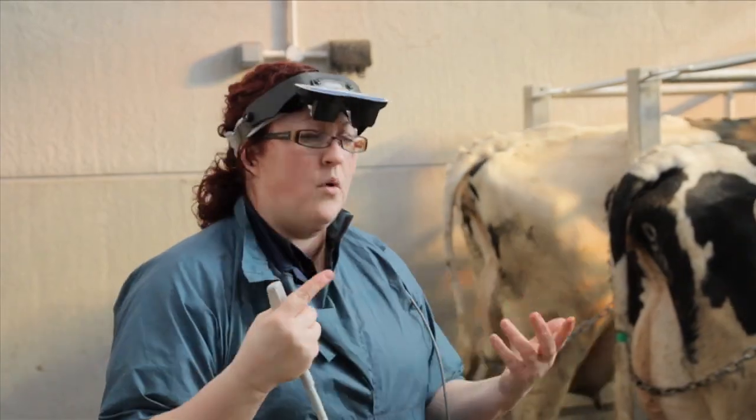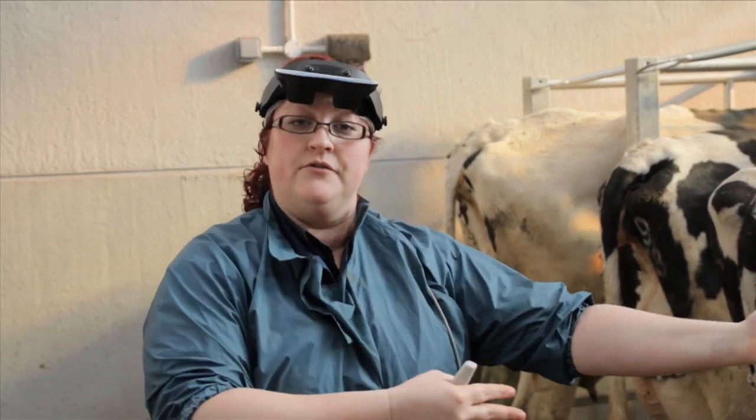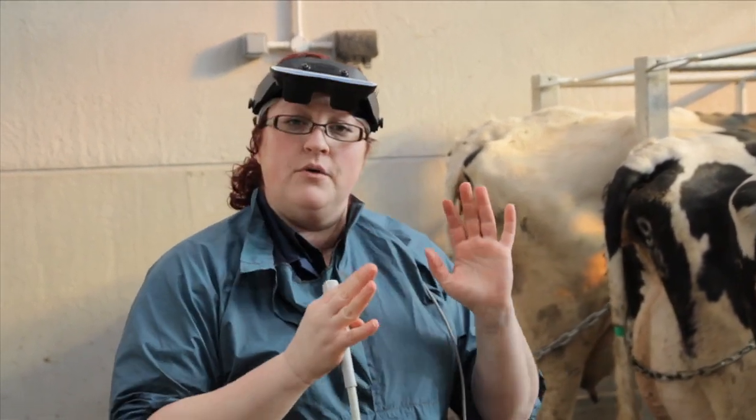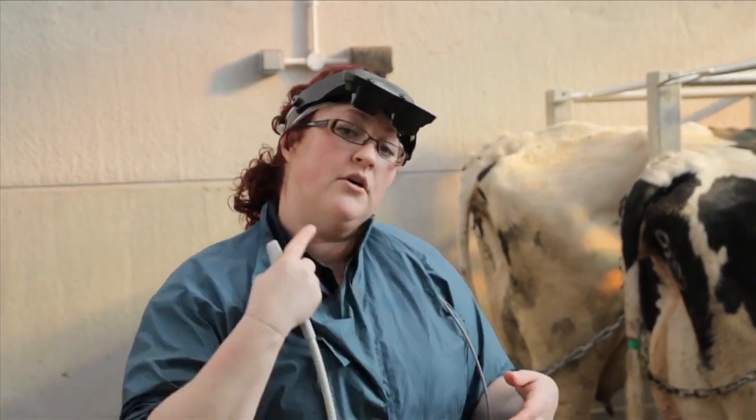What these goggles will allow us to do is actually view the ultrasound image while retaining our peripheral vision. This is important in a farm environment to ensure, again, safety. If you're using a stationary machine with a monitor, just make sure, again, that it's out of the primary footfall of people and cows, and that you are able to visualize it at all times without having to twist your body or crane your neck.